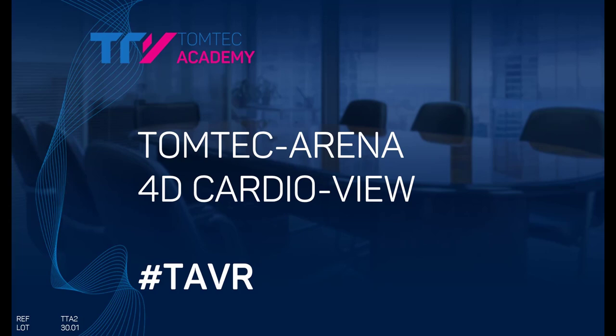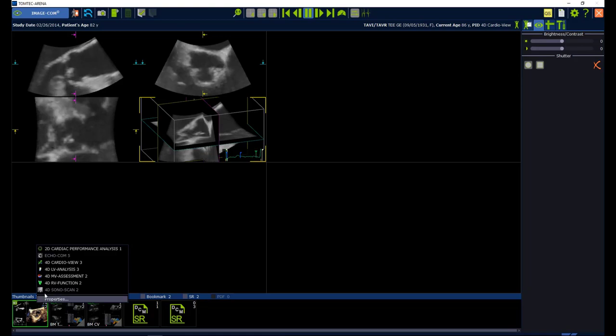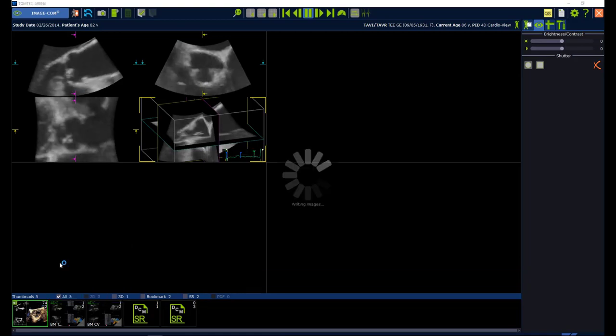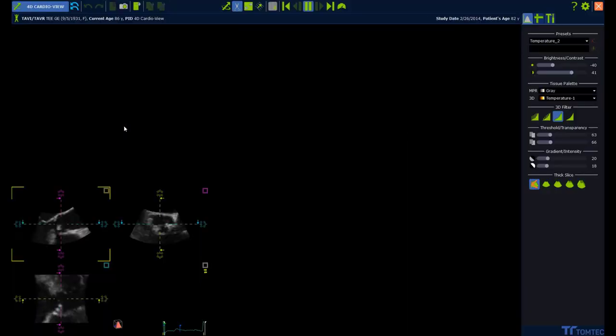How to use CardiView for TAVR planning. Start from ImageCom again. Select a 3D volume, press the right mouse button and select 4D CardiView.